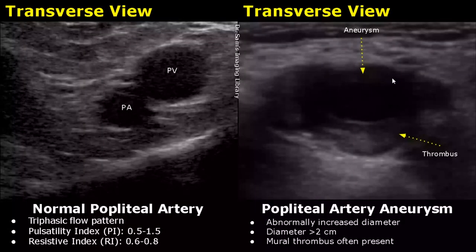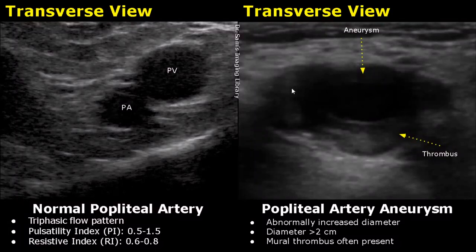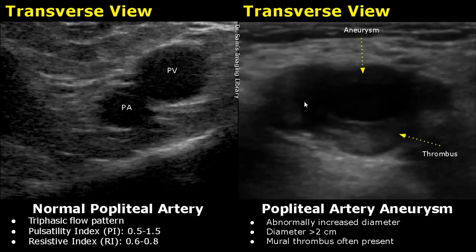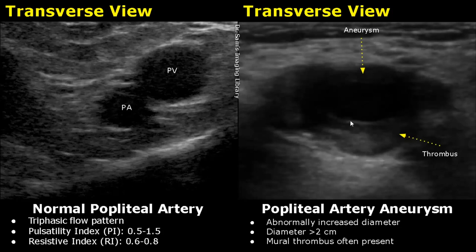Popliteal artery aneurysm refers to the abnormally increased diameter of the popliteal artery. Here is the normal transverse view of the popliteal artery along with the popliteal vein, whereas in this image we can see a very large diameter. The diameter is usually more than 2 centimeters in an aneurysm. A mural thrombus is often present — this small echogenic area is the thrombus, attached to the wall of the vessel, so it is called a mural thrombus.